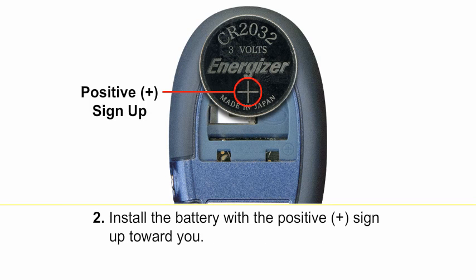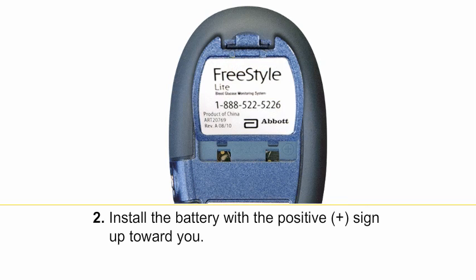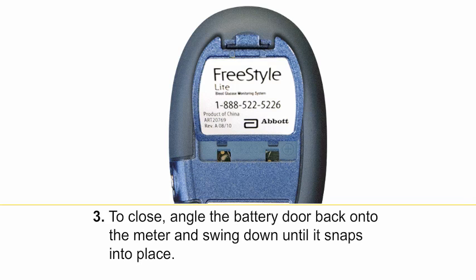Install the battery with the positive or plus sign up toward you. To close, angle the battery door back onto the meter and swing down until it snaps into place.